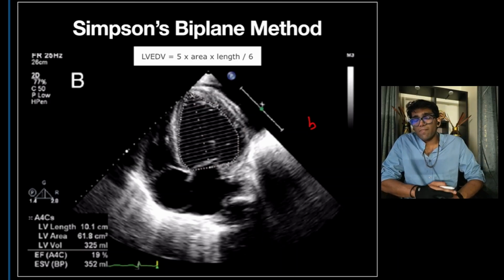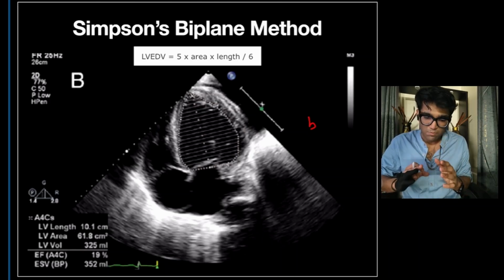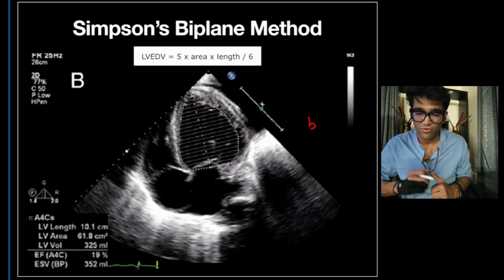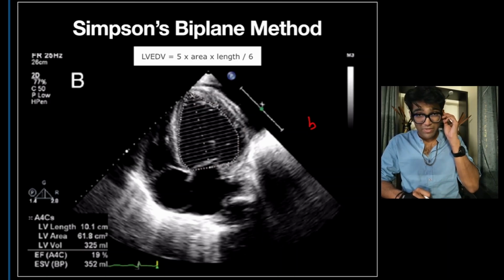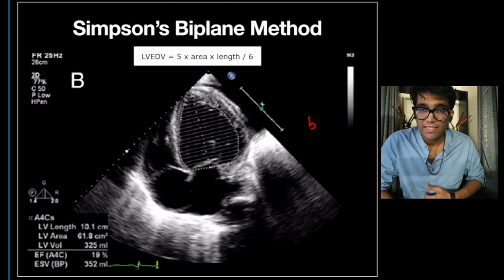And this is actually the best method because it is taking a two-dimensional cut through a three-dimensional structure. So if you have done it as per protocol, and I'm not going into the intricate details of the protocol because that is outside the purview of the video, but you must understand a bit of the methodology. Once it has been done correctly, and there are many sources on the internet that can help you understand the methodology, and the best source obviously is your cardiology department, get assistance from an experienced cardiologist or echocardiographic technician, based on this method we can easily estimate the ejection fraction.